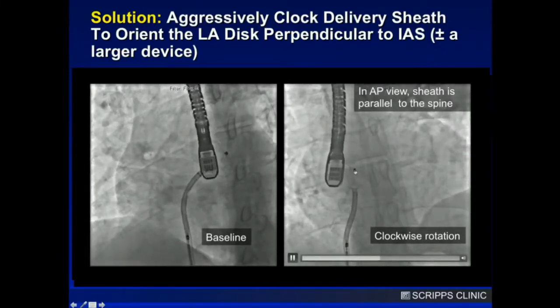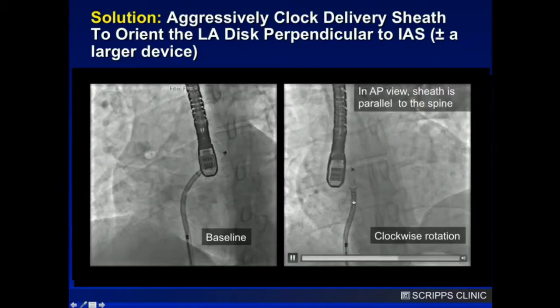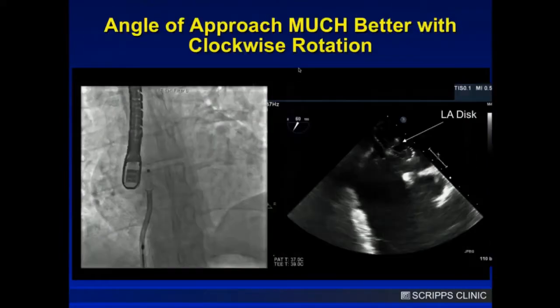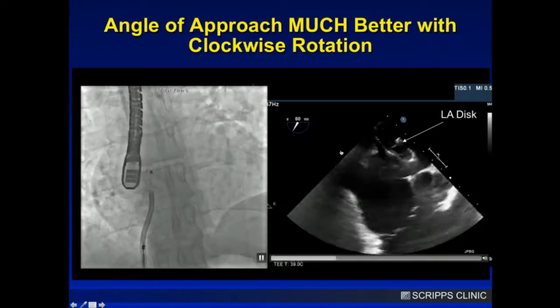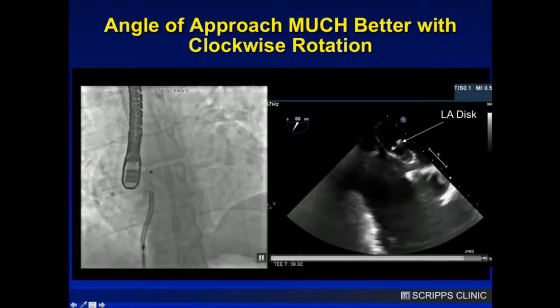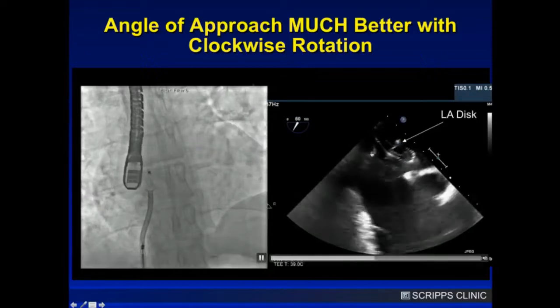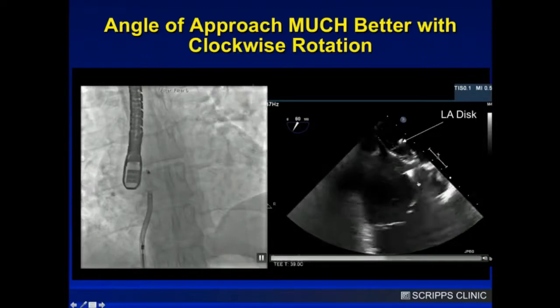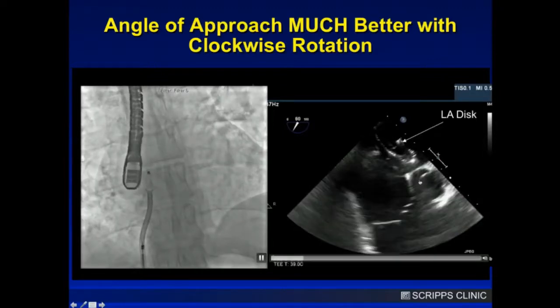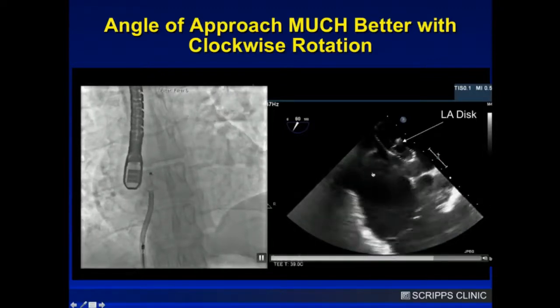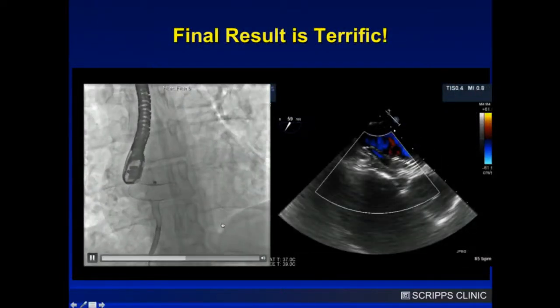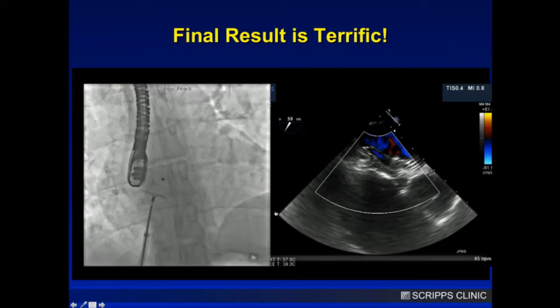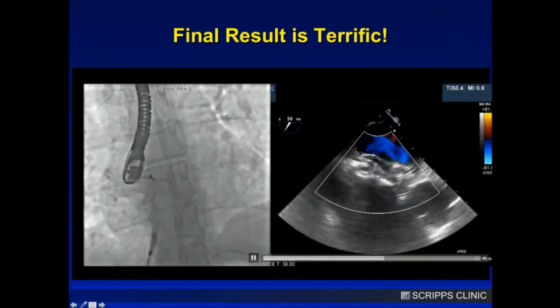I've clocked it aggressively, and now my sheath is straight up and down. You can see what that looks like on Echo — TEE. I have my left disc here; now I'm clearly coming in right, so I'm going to catch the aortic bulb right here and will not slip through. And then as you pull it back, you can catch that aortic rim really nicely and have a great result.